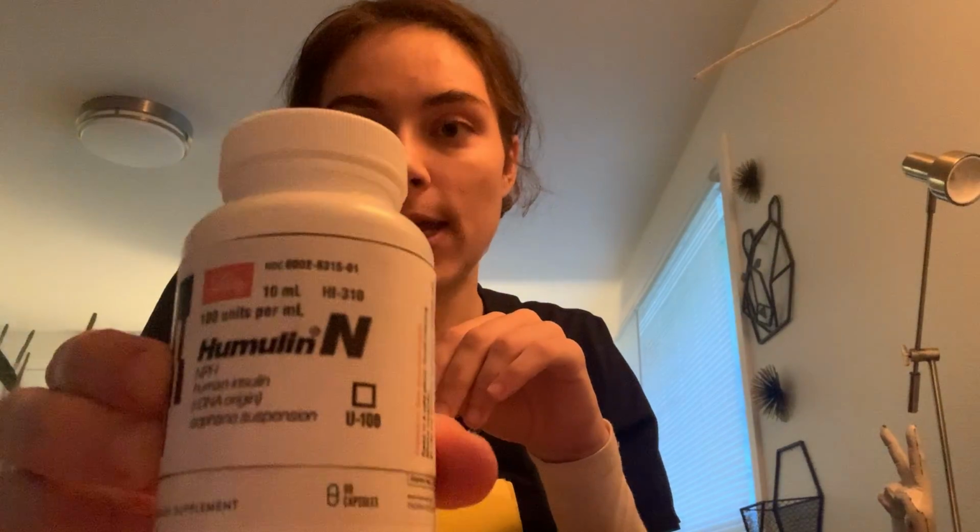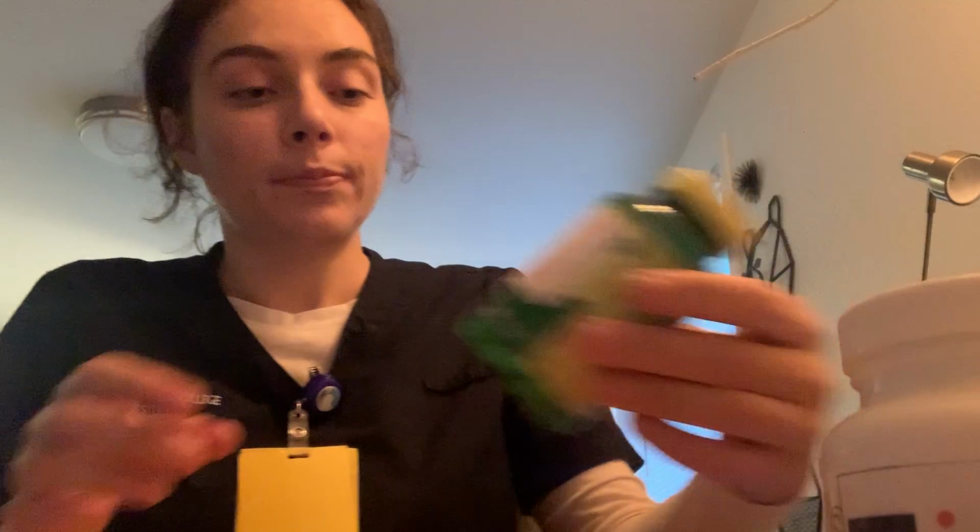Alrighty, so looking at these orders and keeping the test case scenario that she has just finished eating her breakfast. Doing my calculations, I have 12 units of our NPH, which is going to be represented by this here with the proper label affixed to it. I had to get creative with my props. And then we have our insulin Lispro, which we will have to do some calculations on our carbs and also look at our sliding scale provided by our provider. And that will be represented with this prop here, which has the correct label on it.